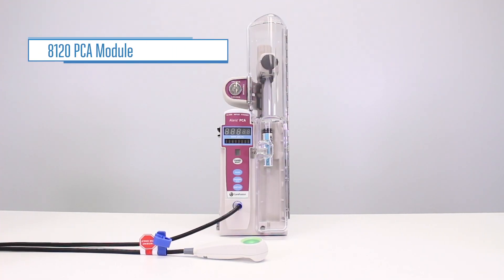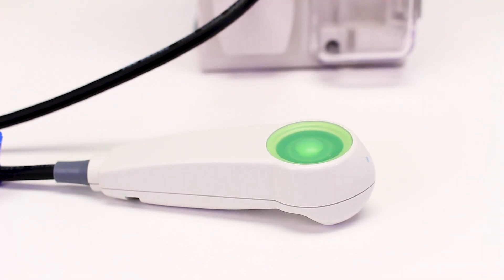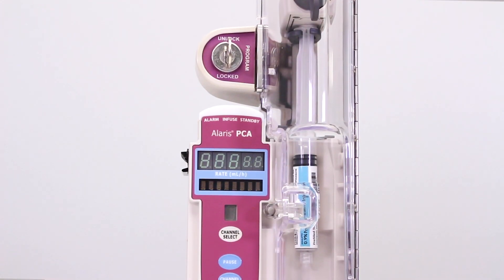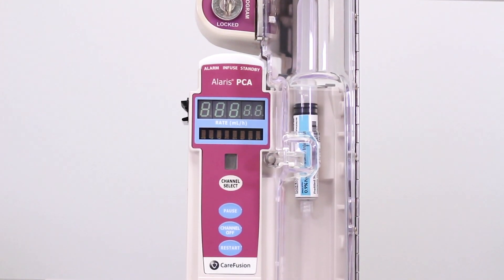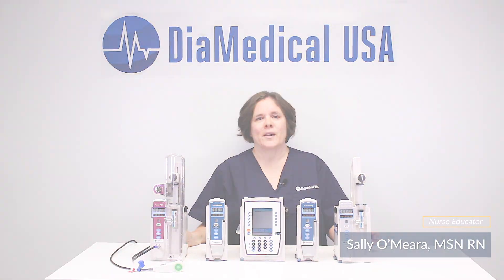The Alaris 8120 PCA module allows patients to self-administer tiny doses of pain medication by pushing a button. The pump has lots of safeguards to make sure that patients do not receive too much medication. This was Tuesday Teachings helping to bring our products into your practice.